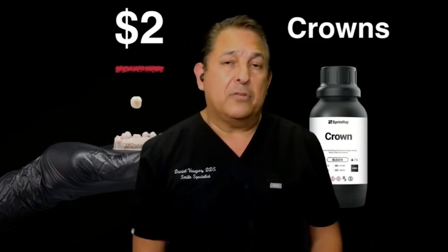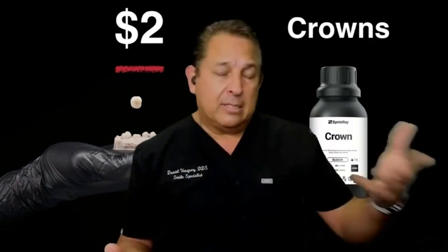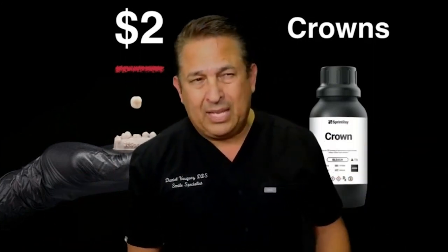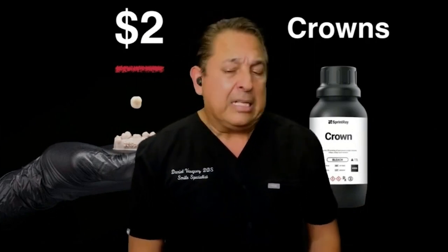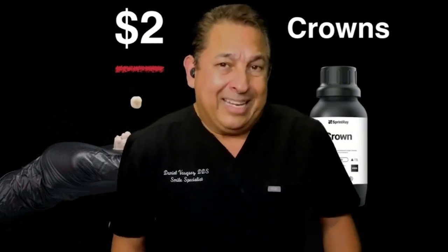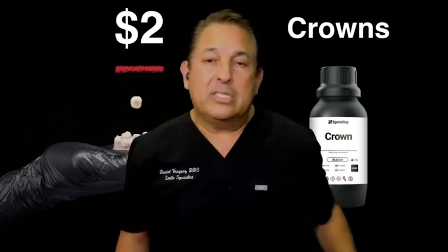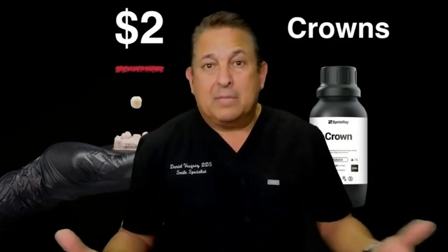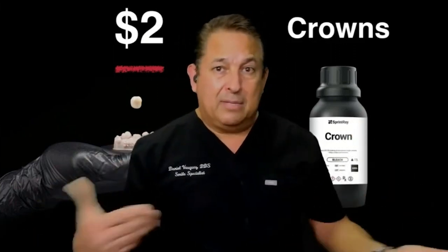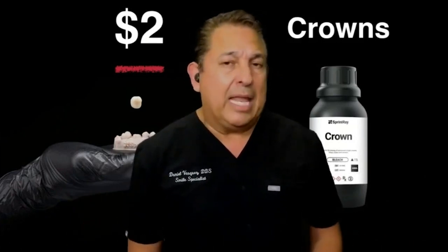SprintRay offers a design service where you scan and send it to them. And I think a crown takes about 1 or 2 days to get back to you, so I don't think that's efficient enough. I think if you have a lab technician that is digitalized, you can ask him, can you do the designs for me and send back to me the STL? Trust me, there are many labs that will do this for you.